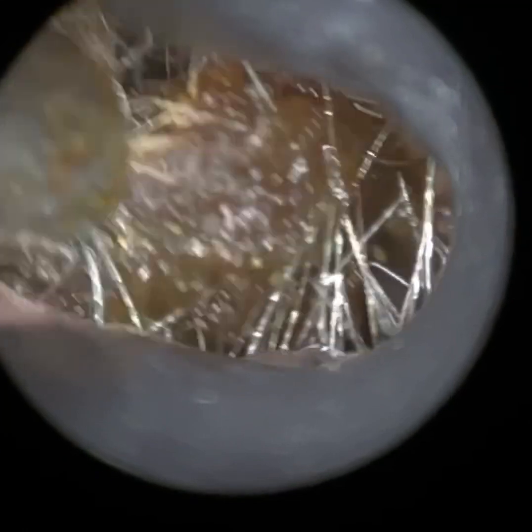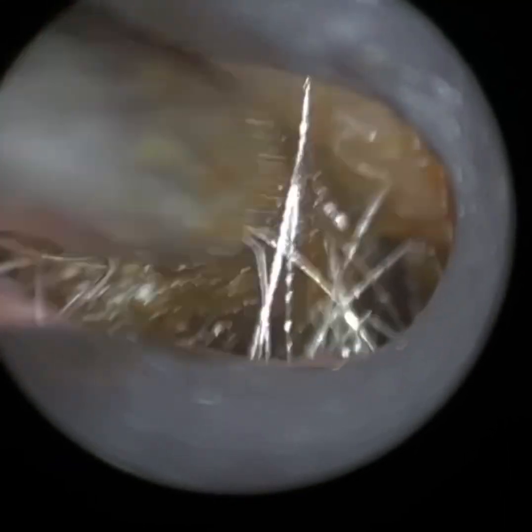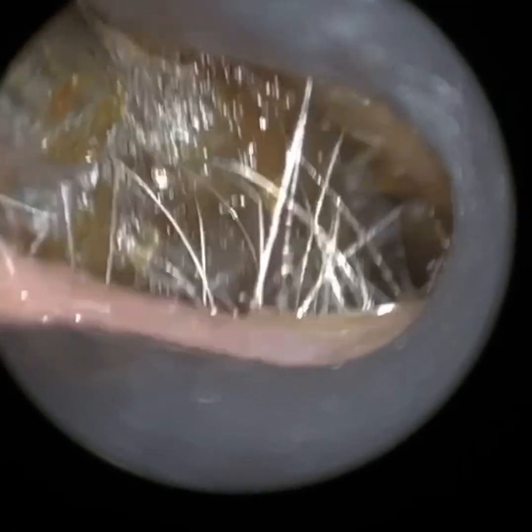These speculums are disposable. These are all prototype speculums — we're just now having them injection moulded, which takes a while. We're just getting all the tooling manufactured, hence we're looking to launch this early autumn.